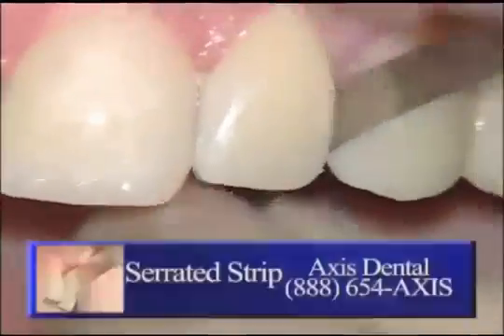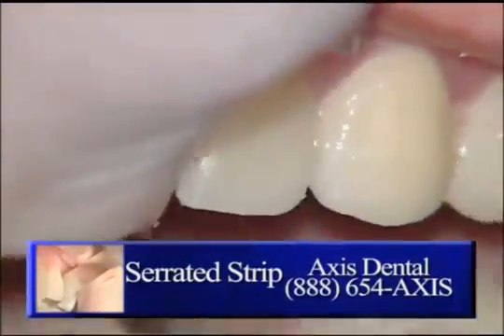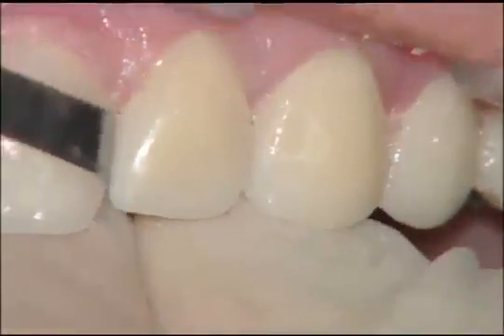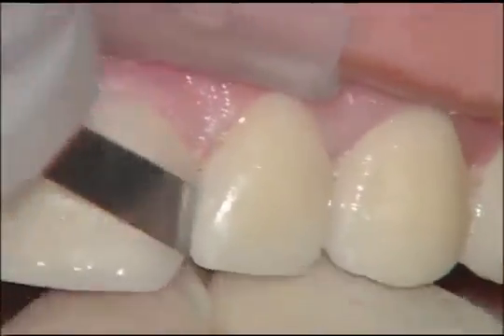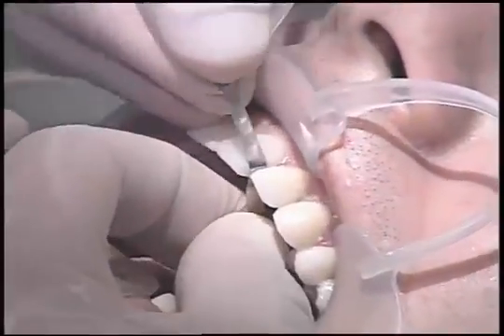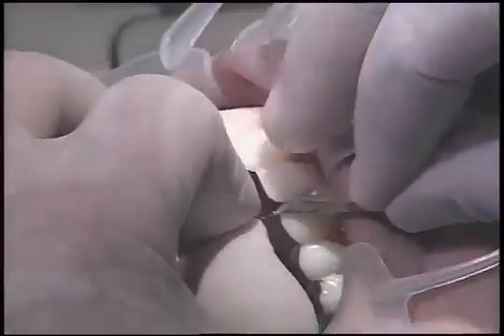If we can't get the floss through, which we weren't able to do between the central and the lateral, we are using a serrated strip from Axis Dental. This is a safe-sided strip that doesn't remove on the mesial and distal, but has serrations on it so that you can cut through any bonded resin, whether it's bonding agent or resin cement, that keeps the floss from going down. Of course, you do have to be careful when you're using this, working it back and forth so that you don't cut the gingiva.